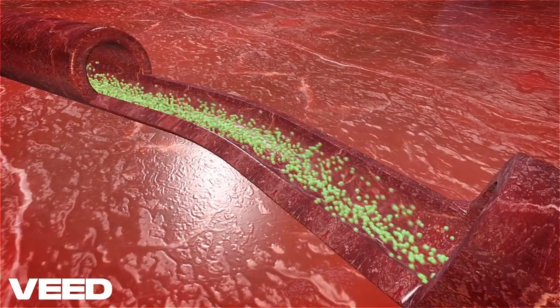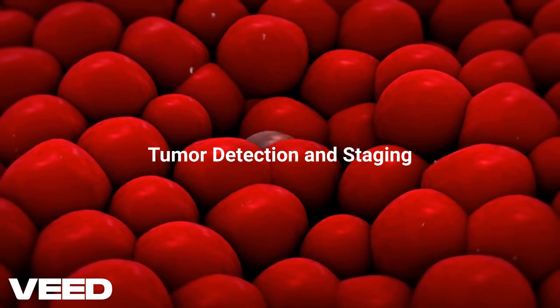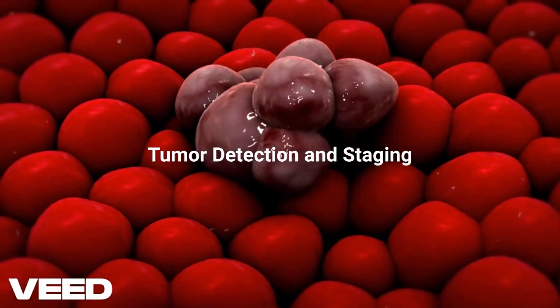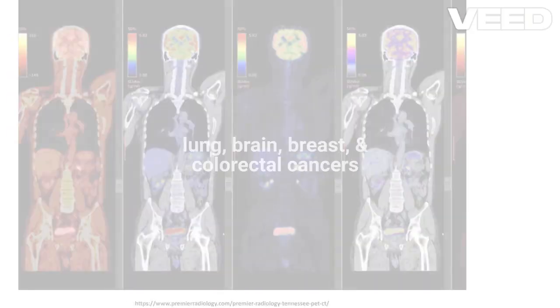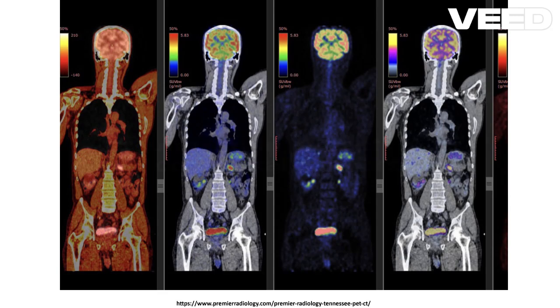So, how exactly is PET used in oncology? Tumor detection and staging. PET scans are key in locating primary tumors and identifying if the cancer has spread. They are used in lung, brain, breast, and colorectal cancers, among others.